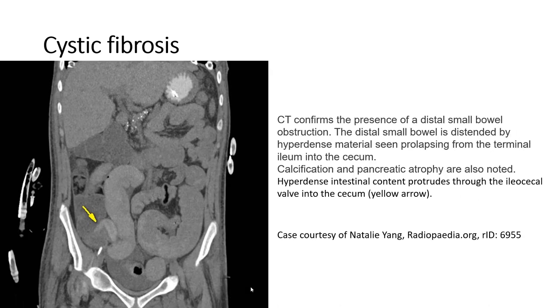This abdominal CT confirms the presence of distal small bowel obstruction. The distal small bowel is distended by hyperdense material seen prolapsing from the terminal ileum into the cecum. We also see calcification and pancreatic atrophy. Hyperdense intestinal content is noted prolapsing through the ileocecal valve into the cecum.